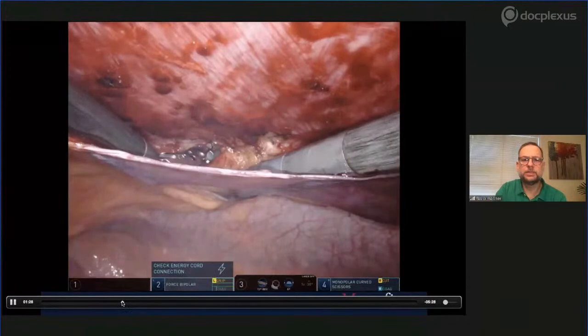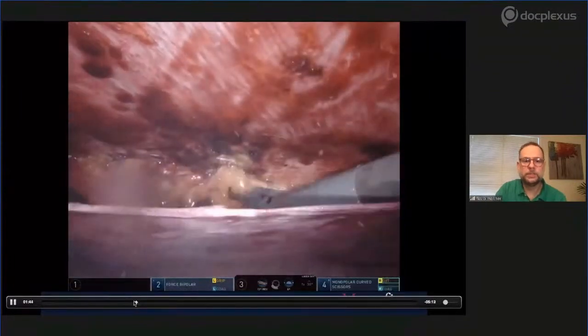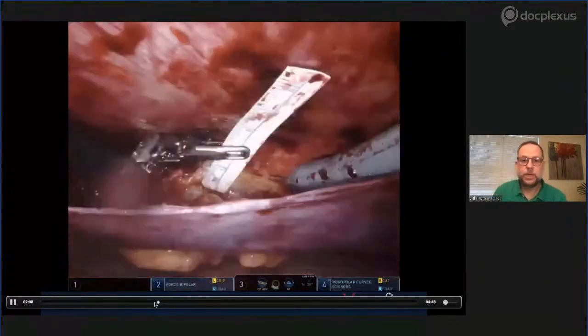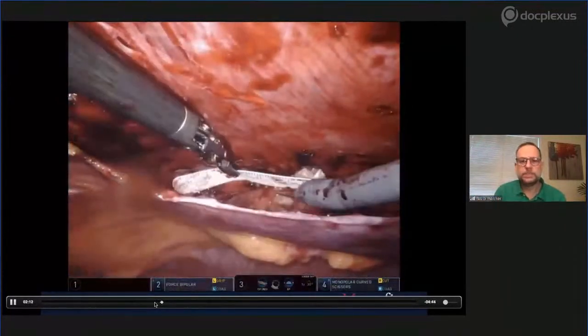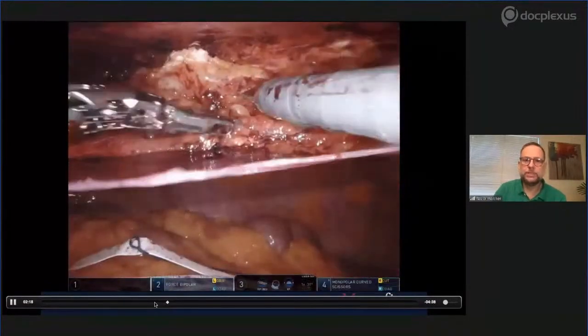We can just start dissecting and reducing the hernia. It was a small 2 centimeter recurrent umbilical hernia. So dissecting, reducing all the content. Now my second space that will be hard is my contralateral side. I use the ruler all the time in my procedures. I want to be cautious that my space will be big enough, but not too big. So I measure myself all the time.